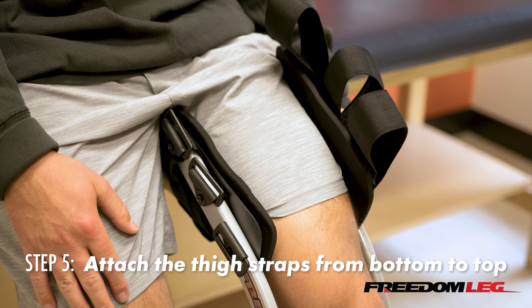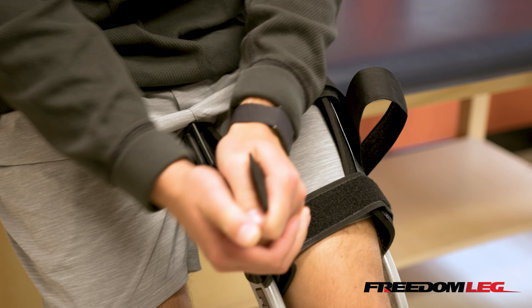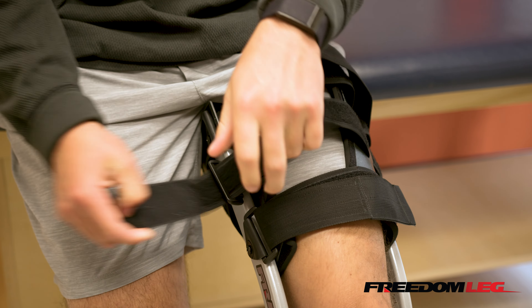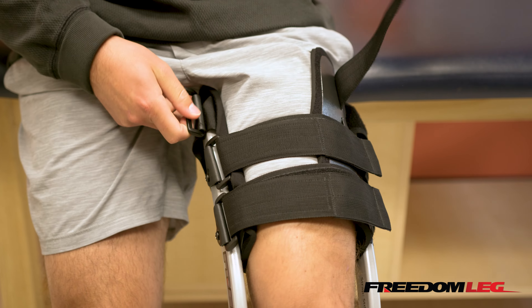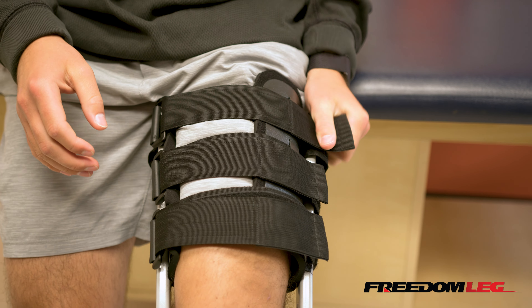Now we're ready to attach the thigh straps. I like to start with the lower one. You want these nice and firm — they're going to minimize motion between your brace and the leg. Make them as tight as you can while maintaining comfort.